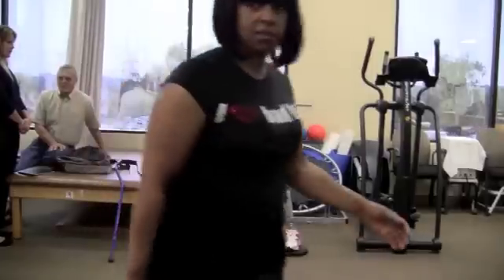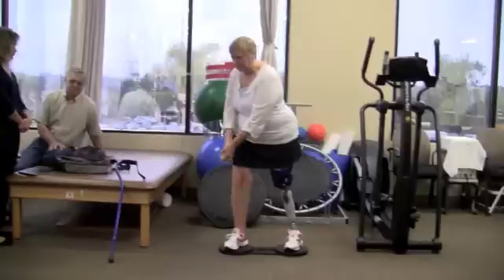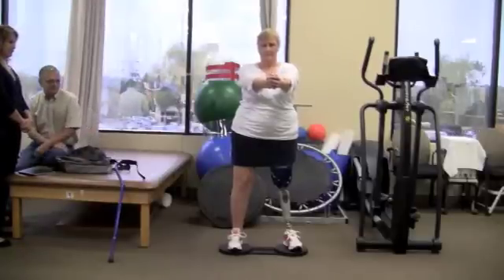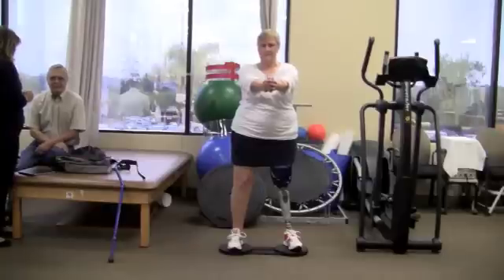I use it a couple of times a day and I haven't fallen. I've been able to go back to work in my garden and not lose my balance. I can close the car door and not fall. I can work in the kitchen again. All of these are activities we take for granted, but activities I wasn't able to do successfully until using the 8-board.